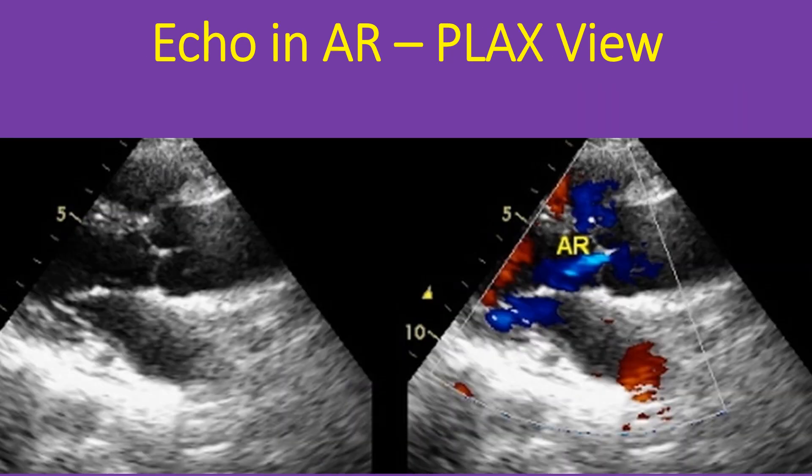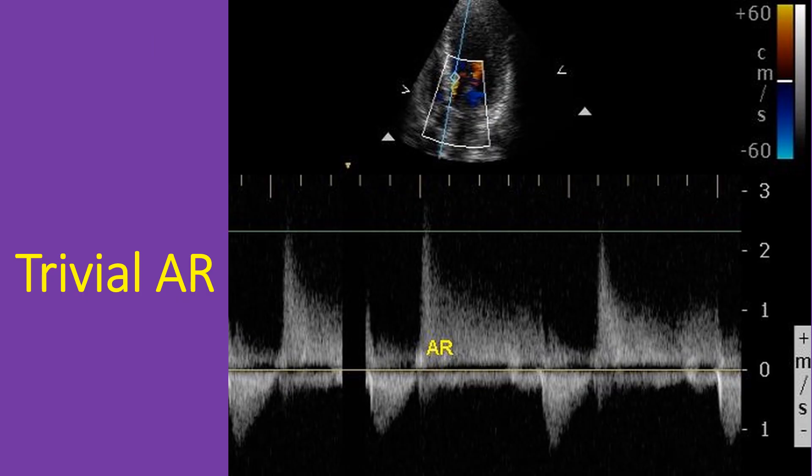Parasternal long axis view showing a small AR jet. Such a small AR jet will be taken as trivial AR with no hemodynamic significance. Left atrium and left ventricle are not dilated. Trivial aortic regurgitation on Doppler interrogation from the apical 5-chamber view is seen as a 2D image in the upper panel. An incomplete image of the jet is obtained when the regurgitation flow is less, as in trivial or mild AR.